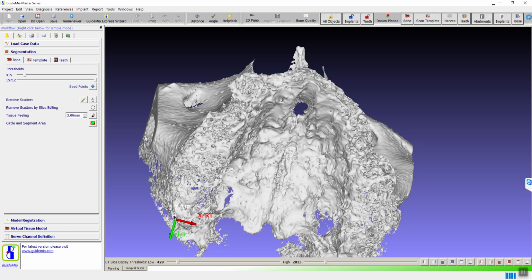And also, it's very important to maintain the overall shape of the bone structure. Yeah, this is a pretty Swiss cheesy bone. We should have made the area smaller, so we're pretty much at the maximum size of the upper jaw, so it takes a little while.